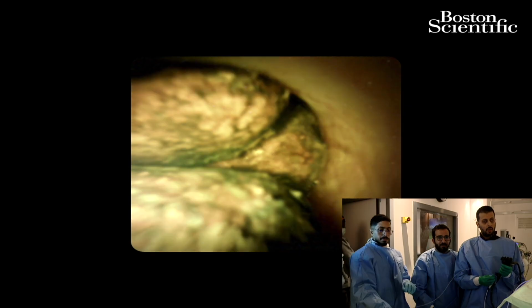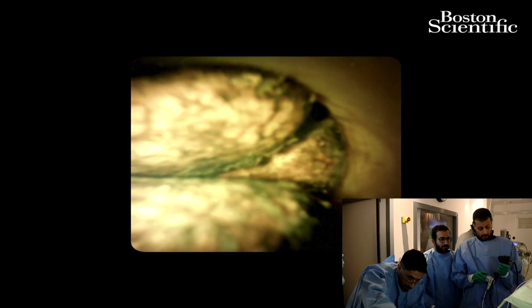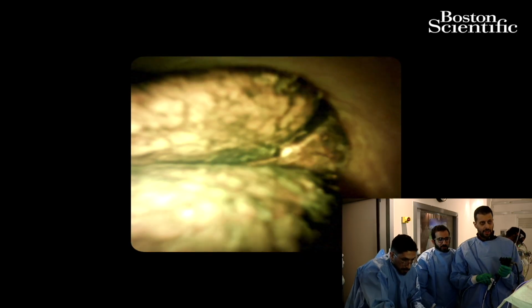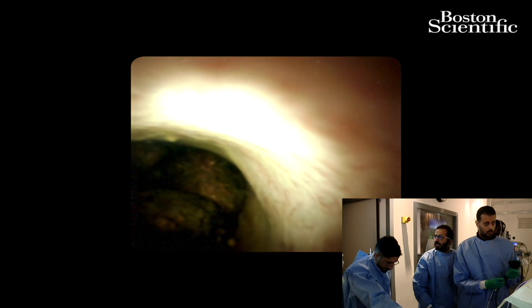Let me see here. I have the fluoro. Okay, so first let's try to unlock here. Okay, so there is a lot of resistance. So I'm going to unlock my SPY wheels. That may help elevate, and I'll try to go sometimes a bit long. Can we also have the fluoroscopy picture, please?